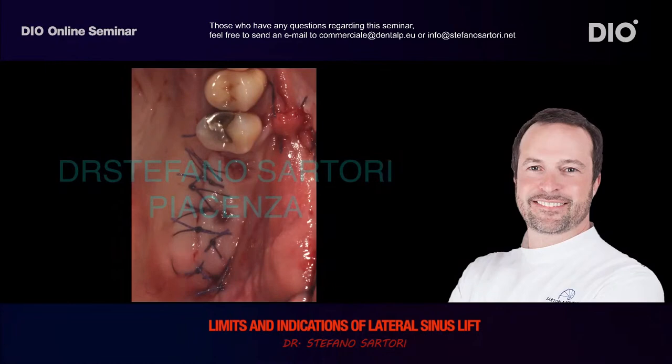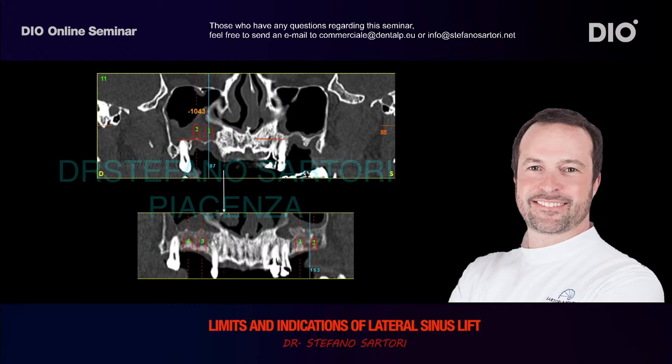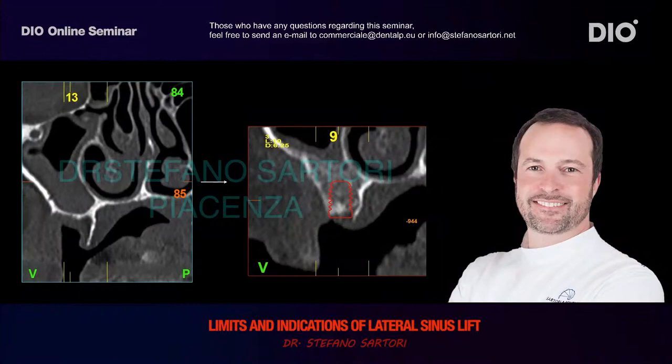and after some months, the re-entry. Even in this case, you can see the insertion of the muscles at the crestal level. Even in this case, I have to move the keratinized tissue from the palatal aspect to the buccal aspect. And look at the combined aspect after bone regeneration. Look that we have gained bone tissue even coronally to the residual crest in the posterior sectors. This is on the left before the surgery, on the right after surgery.